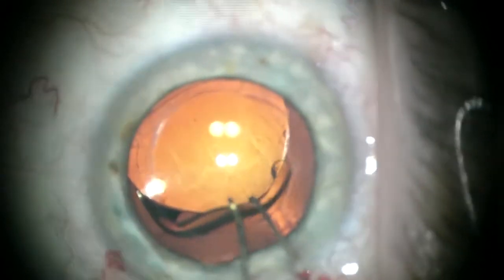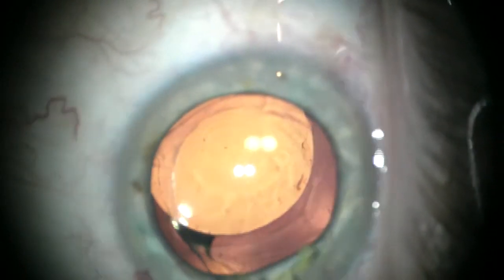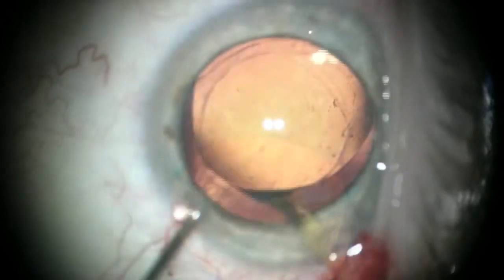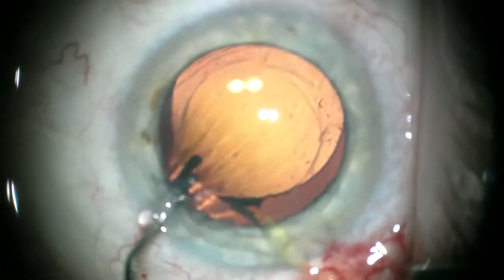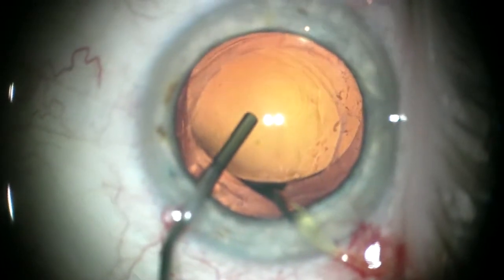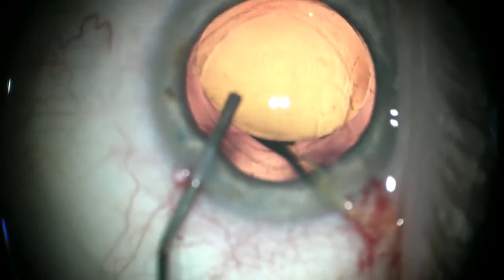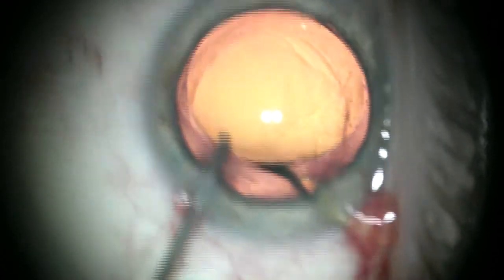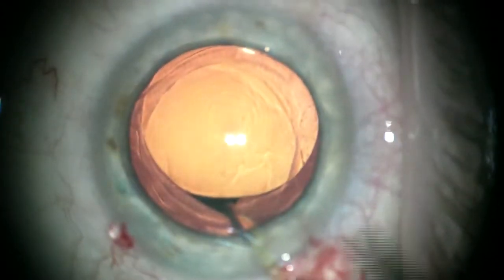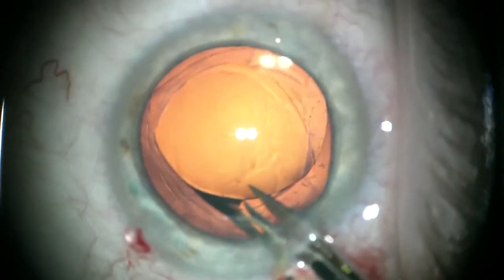We're loosening it and getting the lens — at least the first haptic — out. You can see how I use two instruments: a spatula under and a Sinski hook on top of the optic, and just pinch it like two fingers and bend it near the tip to get the end out of the anterior chamber.